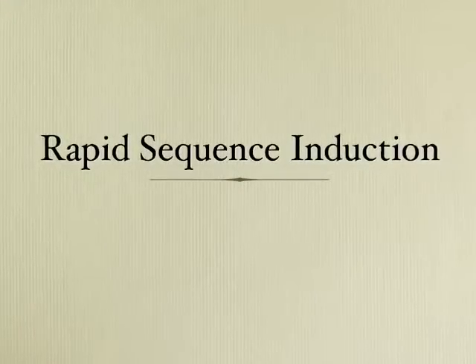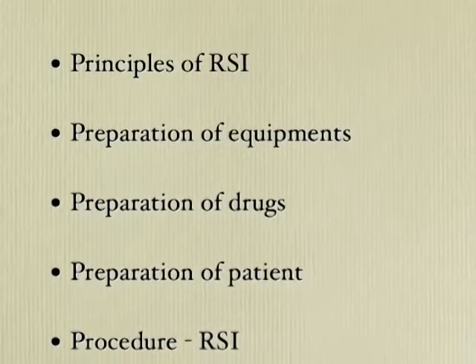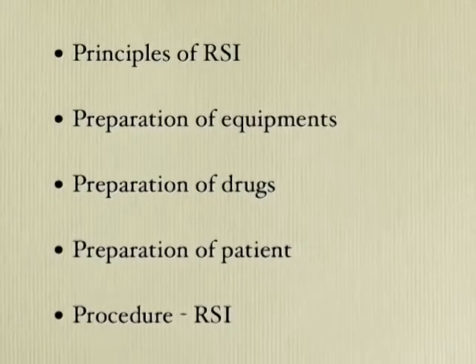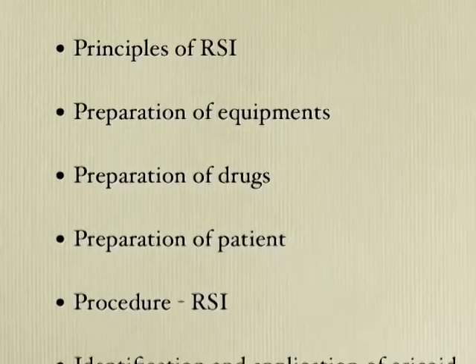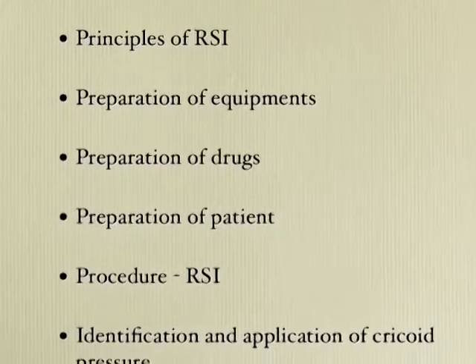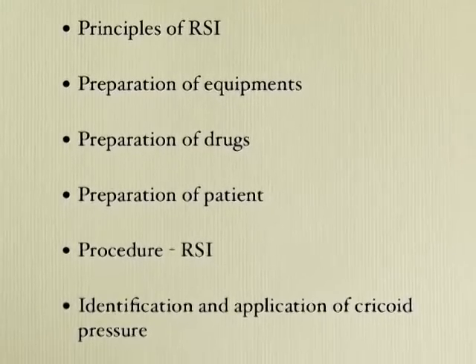Rapid sequence induction. In this video, we will highlight the principles behind rapid sequence induction. We will look at the preparation of equipment, drugs, and the patient for a rapid sequence induction. And we will also demonstrate the procedure with a detailed emphasis on the identification and application of cricoid pressure.